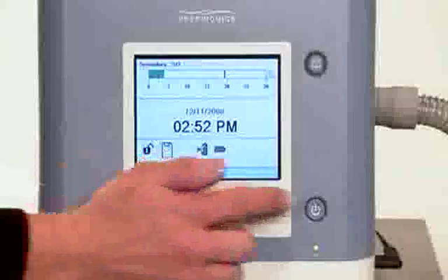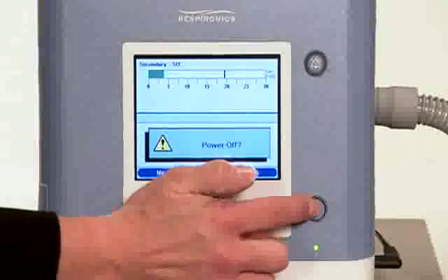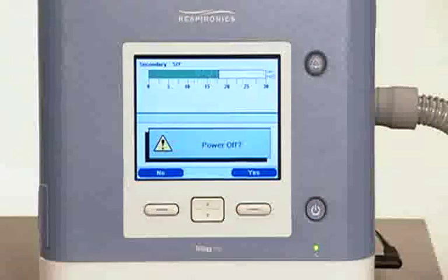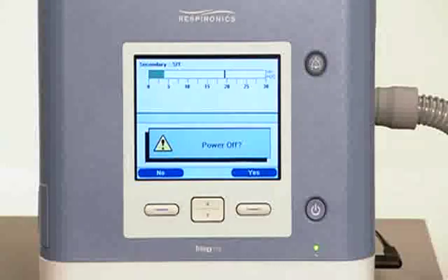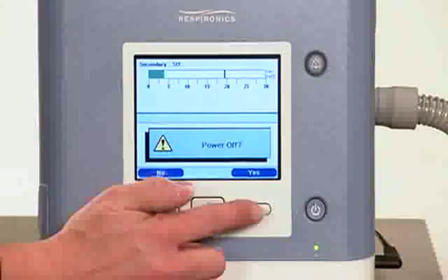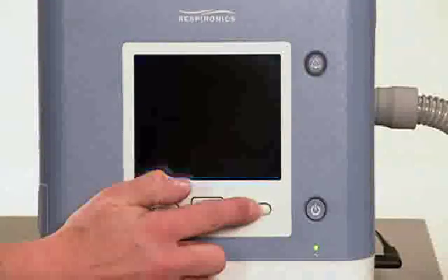To end therapy, press the start-stop button on the front of the device. You will hear a short tone. The display screen will pose a question: power off? Press the right button to answer yes. The back lights and display screen will turn off.